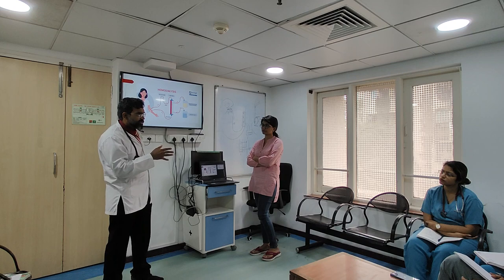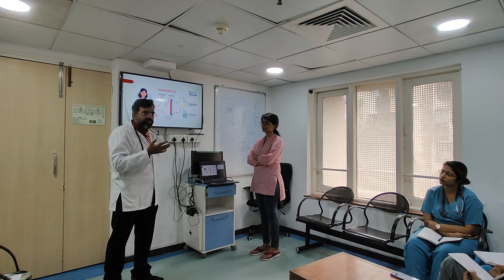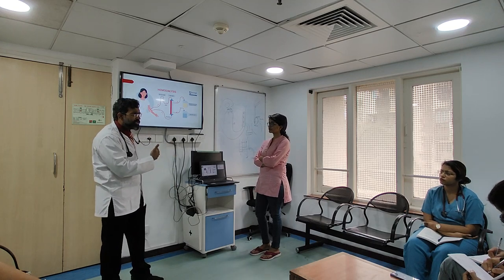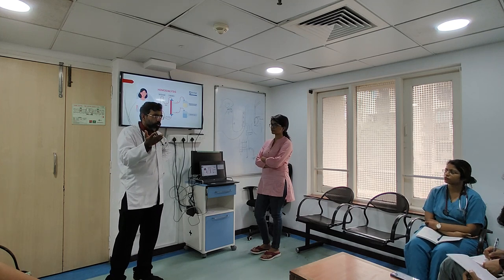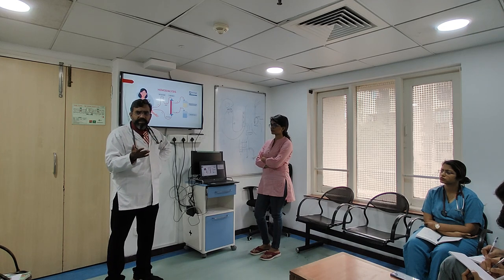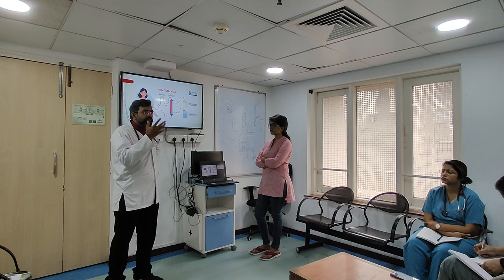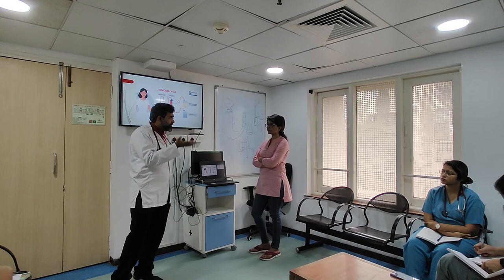We use solutions because we need to understand the balance, because this machine is an AI machine. The machine has artificial intelligence which is telling us how much weight has decreased, how much weight has increased, how much fluid went in, how much fluid has decreased. Of course, there are new CRRT machines slowly coming which are actually using RO also, but we have not really explored that as of now. It may be very expensive because the AI will be on a different level there. Here the CRRT has an AI which requires the weights to be seen. The weight is understood by the weight of the solutions that are kept on the weighing scales. Okay?